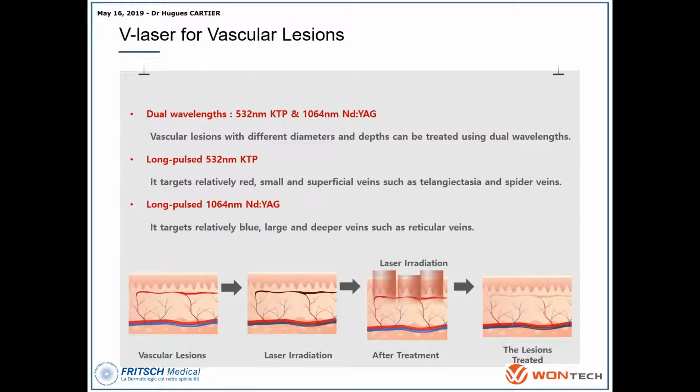You can modify it, without cooling handpiece, or sometimes you can put 5 degrees, 10 degrees. Nobody speaks about the possibility to modify the setting of the freeze on the cooling handpiece, but it's very important, because sometimes to destroy some superficial pigmentation it is very important to reduce the freeze, the cooling, but for large vessels, it's very important to reduce to around maybe 5 degrees. Very important to understand that. But with the possibility of this device, you can modify it as well as you want.